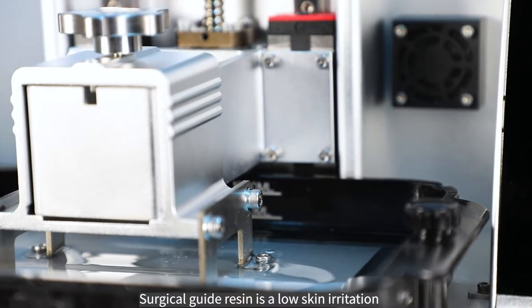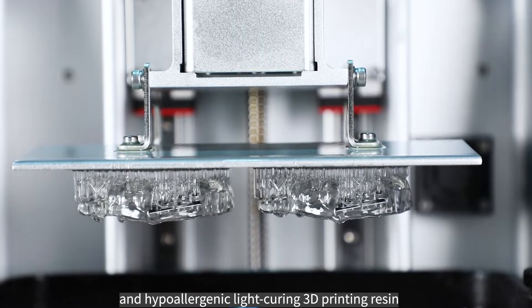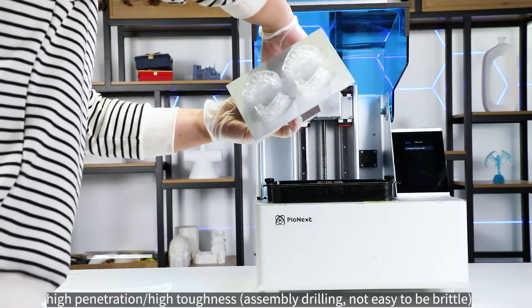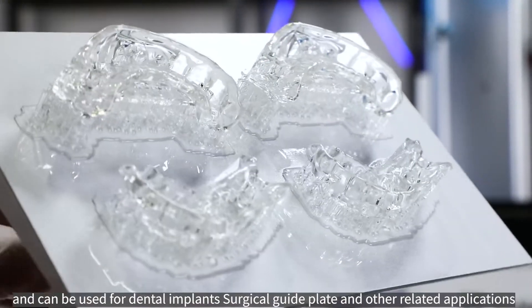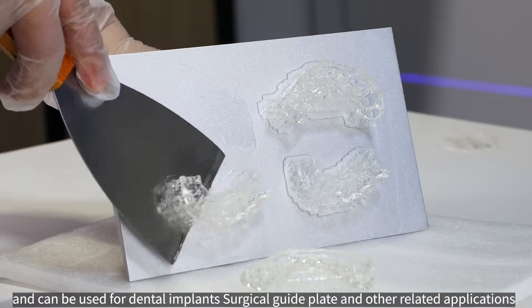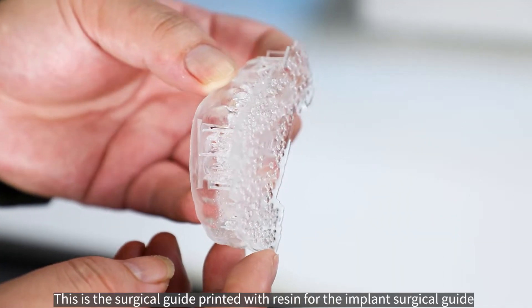Surgical guide resin is a low skin irritation and hypoallergenic light curing 3D printing resin. This resin has mechanical properties such as low shrinkage, high penetration, high toughness, easy assembly drilling, and is not easy to be brittle. It can be used for dental implant surgical guide plates and other related applications.